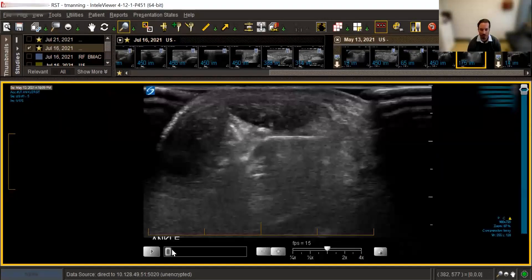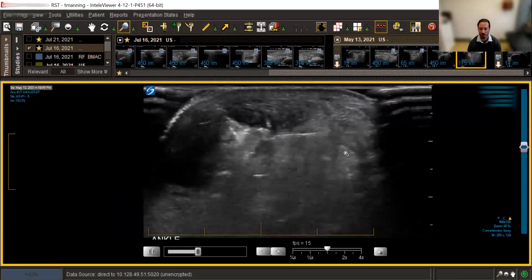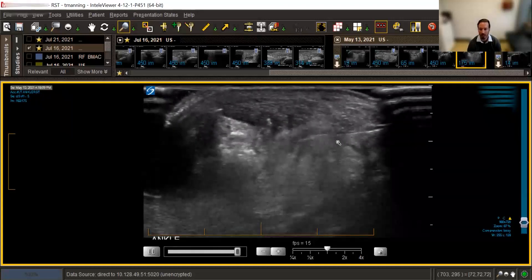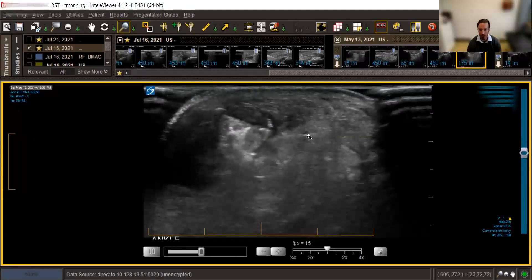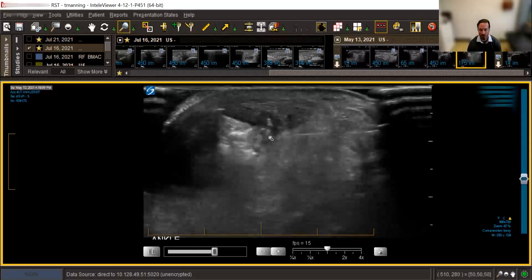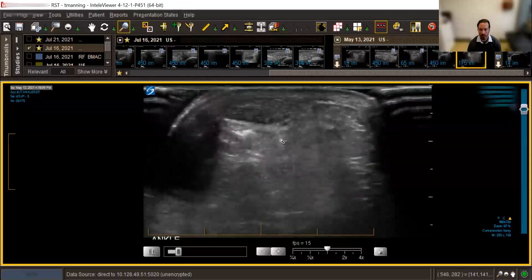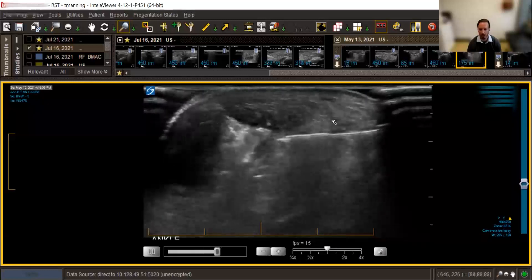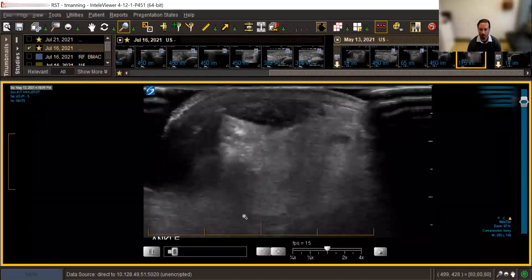This first video shows the technique of injection of anesthetic prior to any sort of hydrodissection procedure. This is coming from lateral to medial, paying attention to the coursing of the sural nerve as you're doing this injection. As you can see, there's infiltration of anesthetic fluid along either side of the Achilles tendon — making sure to look not only in short axis but also long axis — to ensure you're going along the entire length so the patient has decreased discomfort for this procedure.